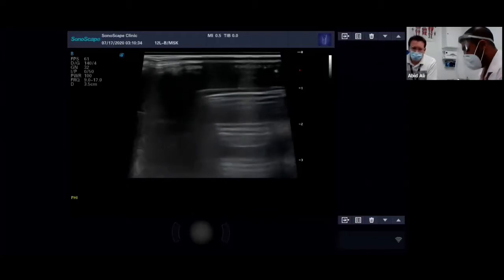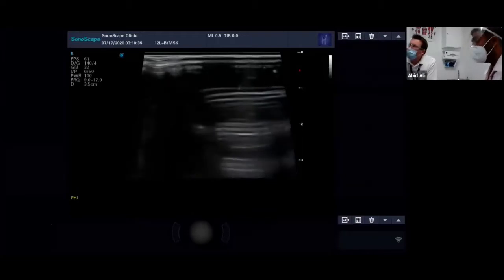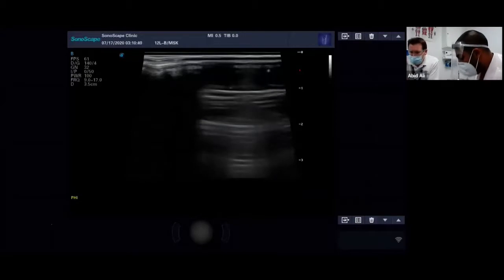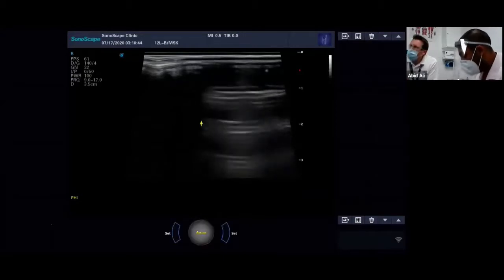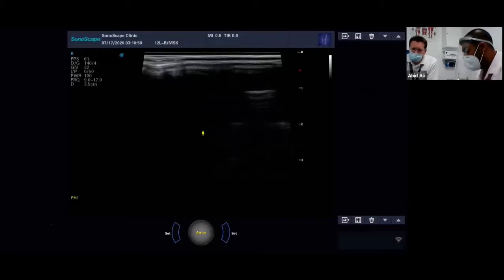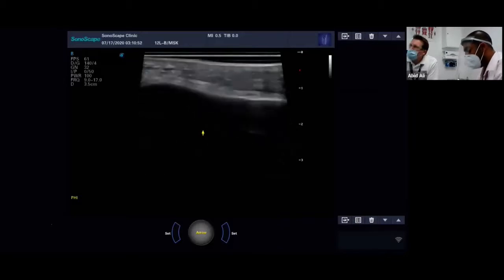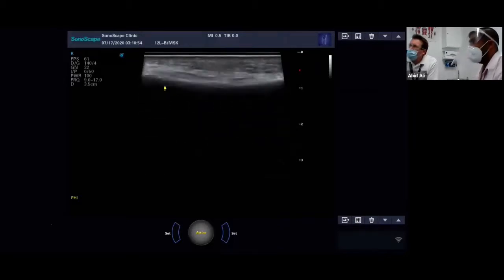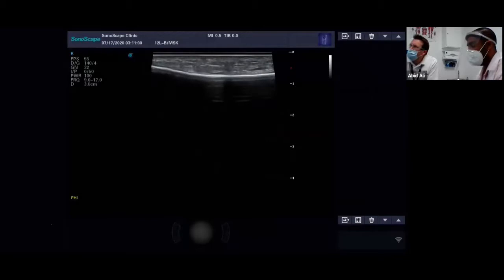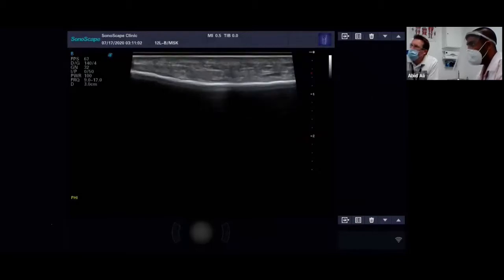Okay, so with our gelled probe, we're going to start off somewhere on the lower third of the shin. So palpate your bony landmarks, find the medial ankle bone, and you know you're pretty much on the tibia. You want to start with a local bony area that you can easily see. So straight away you can see we've got a very thin layer of skin at the top here and a little bit of tissue, and then we're straight onto the bone.